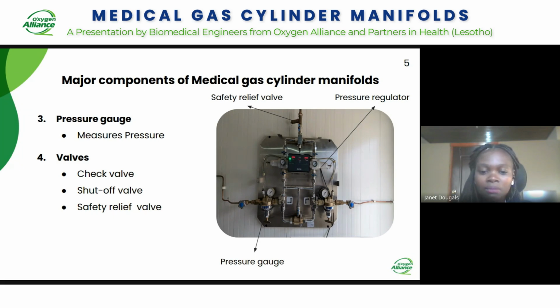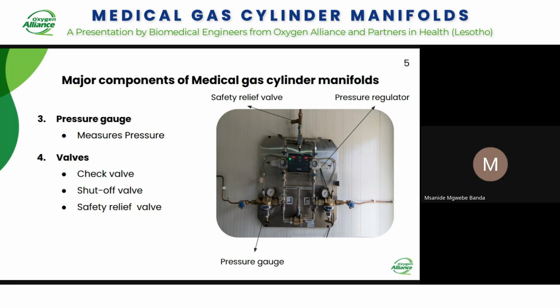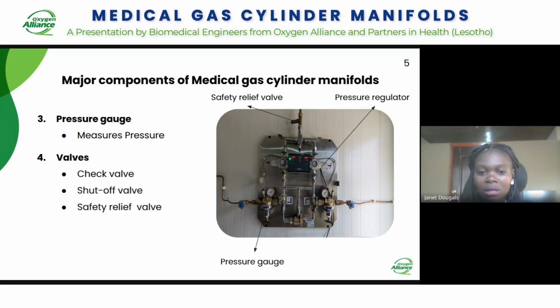And in the picture there are a number of regulators that you can have, because you actually need a regulator for the primary bank. You also need a regulator for the secondary bank, and even within the piping of your manifold. And you also have valves. In this case, I'll be talking about the automatic valves that you have within your manifold.